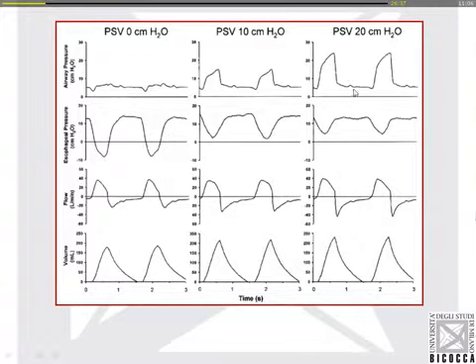So basically, the idea is that the sum of the pressure that the ventilator and the patient are generating is constant, but by rotating the knobs on the ventilator, we can decide which should be the trade-off between the patient and the ventilator.